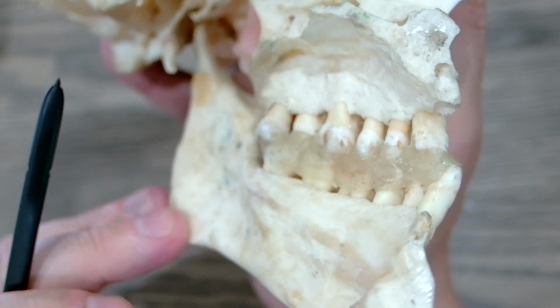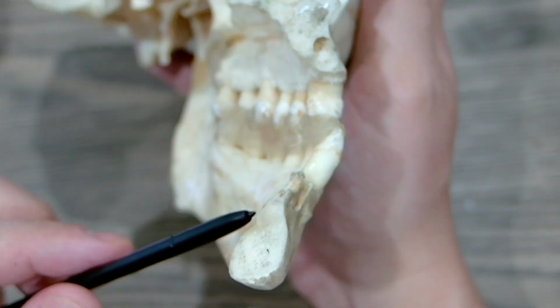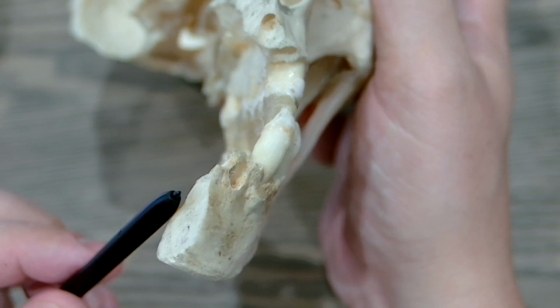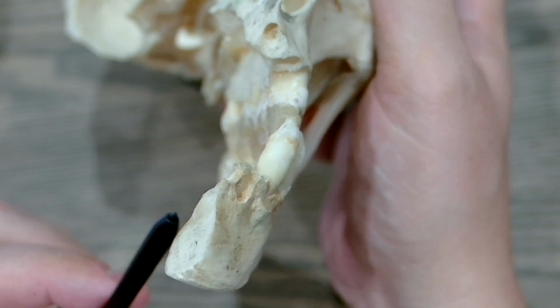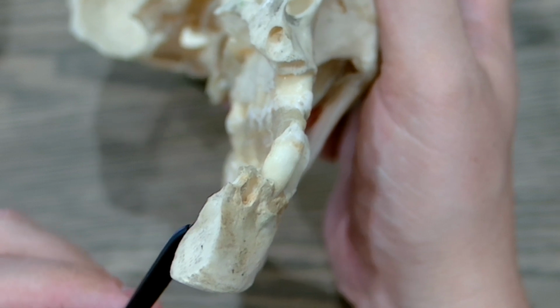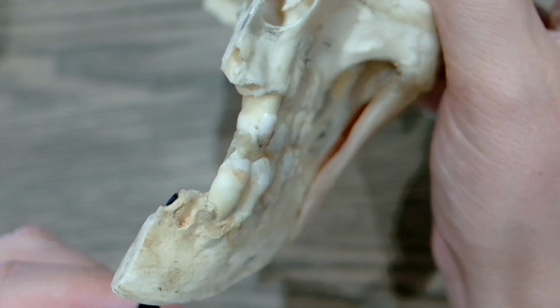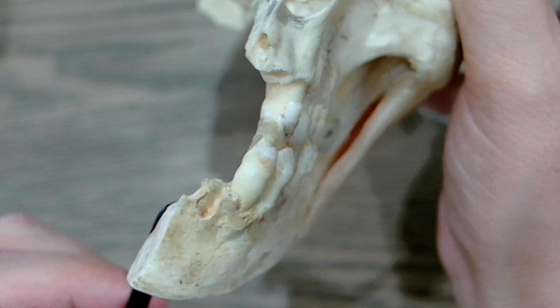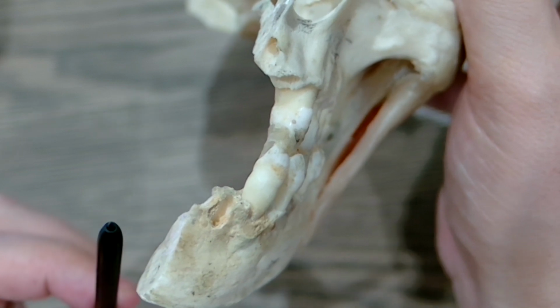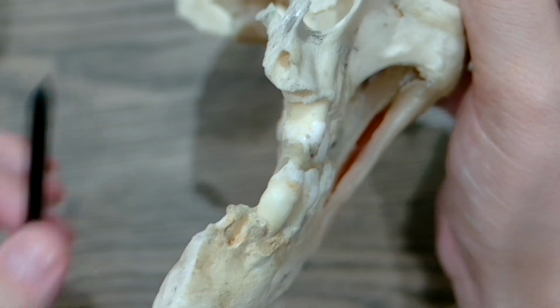The last area to be concerned with is the mandibular anterior region. Right here, the lingual aspect is heavily vascularized as well. I would recommend any time you do a mandibular incisor implant, reflect the lingual flap to at least your anticipated drilling depth.